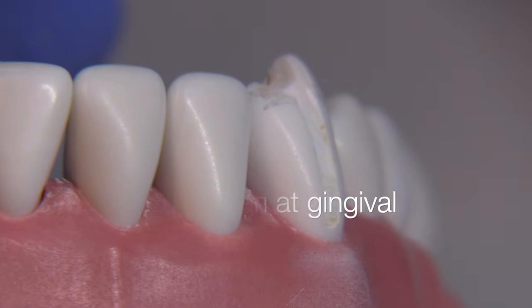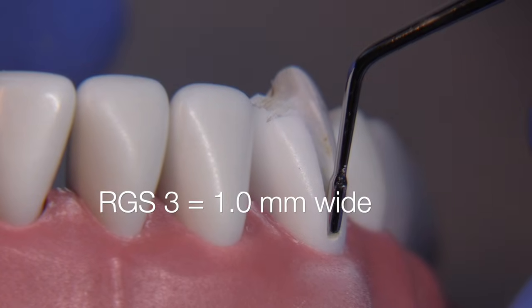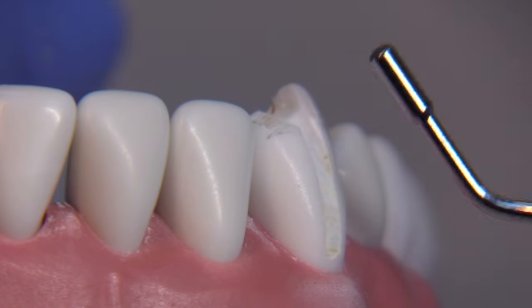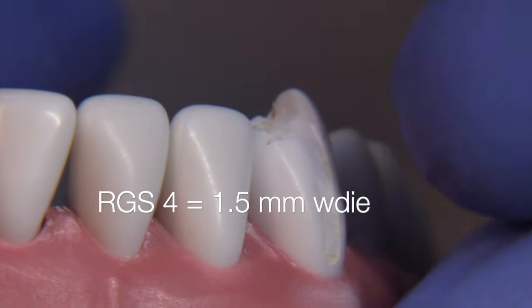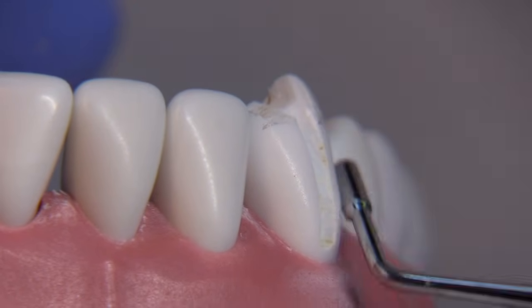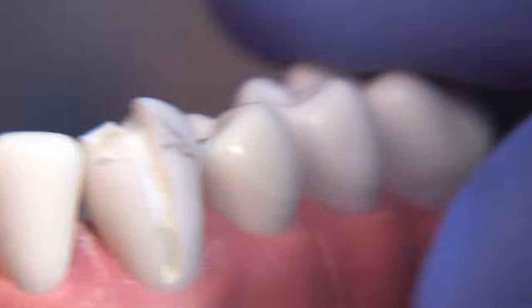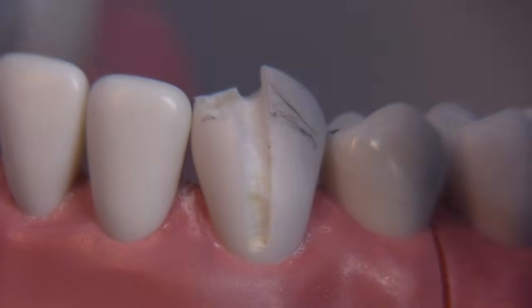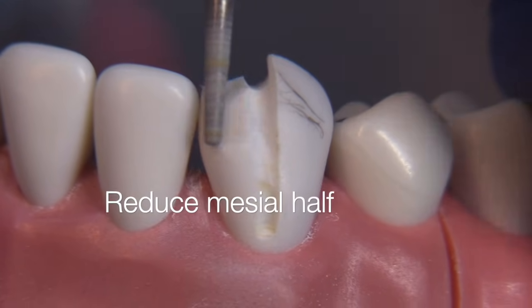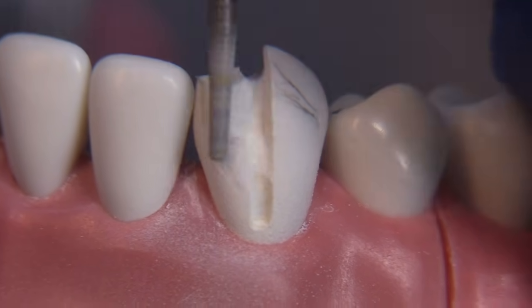Using an RGS3 to measure that one millimeter we're looking for at the gingival. You don't want to be less than one millimeter, otherwise the ceramics cannot be made aesthetic. An RGS4 confirms we are 1.5 millimeters deep axially at the incisal portion — so there's a gradual increase in the amount you reduce as you go up towards the incisal. Let's continue reducing the mesial half following the contours already established, right down the middle.